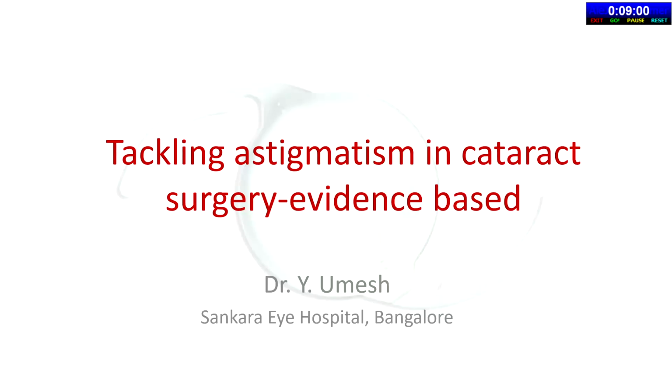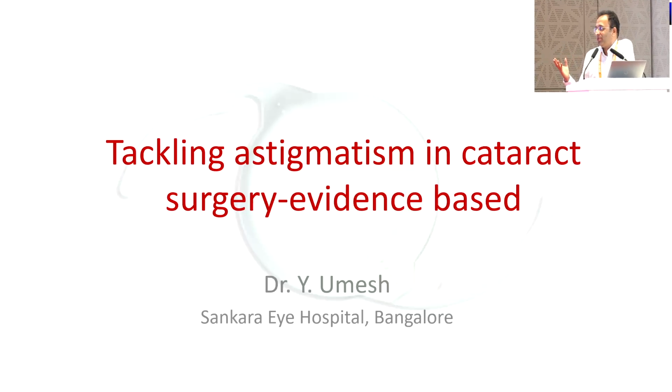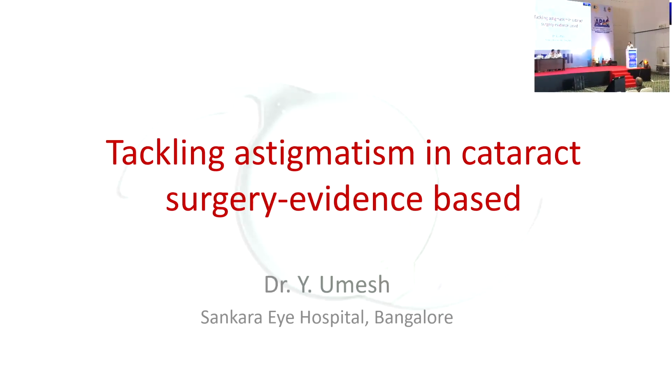Yeah, it's very surprising, you see. With multifocals, they say the very happy patients are the hyperopes, and angle kappa is high in hyperopes. Correct. Definitely. Somehow I'm not able to get that. When I was preparing for this presentation, I found there are many studies which have looked at angle kappa and the patient is happy at the end of the day. Multifocals are very good in hyperopes. That is proven. So hyperopes have high angle kappa. So that means the theory is matching.